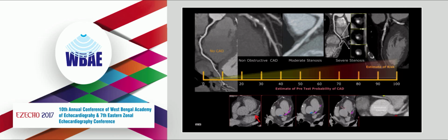And even though there is no obstructive coronary artery disease, he is at risk for future events based on coronary artery calcification. As the calcification increases or the location becomes more and more proximal, the risk of future events increases significantly more. Compared to any other classification system, including Framingham risk factors or any other way of classifying risk, coronary artery calcium is turning out to be the best test that you have.